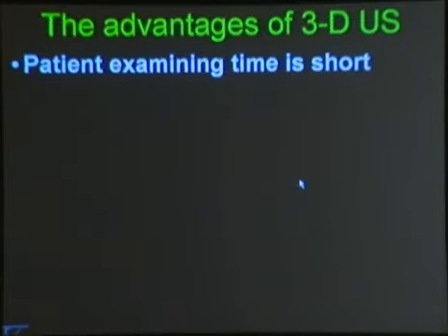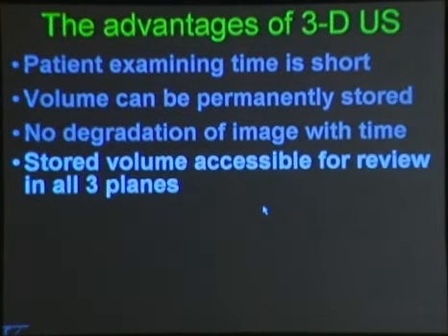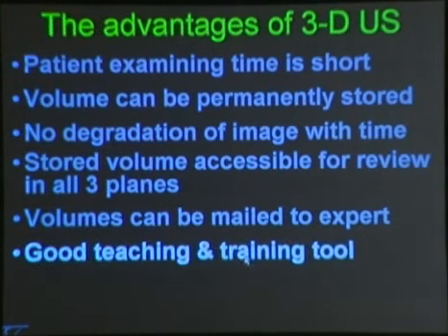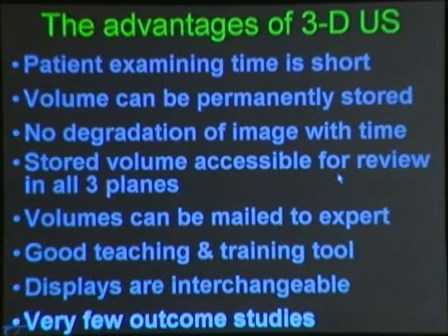So the advantages of 3D ultrasound in GYN is that patient examining time is short, the volumes can be permanently stored, no degradation with time. The volumes are accessible for review in all 3 planes. They can be mailed to an expert. It's a good teaching and training tool, and the displays are interchangeable.